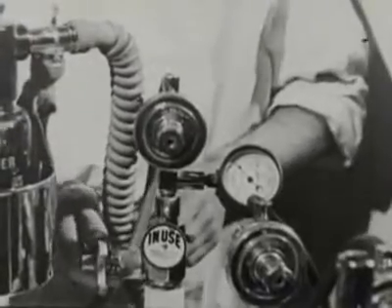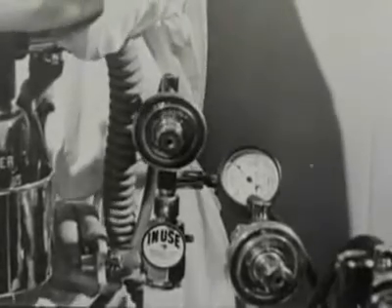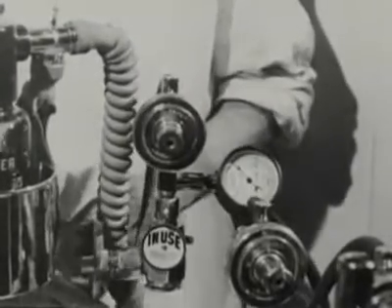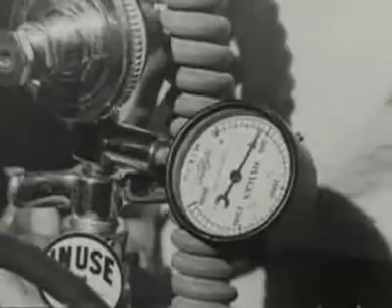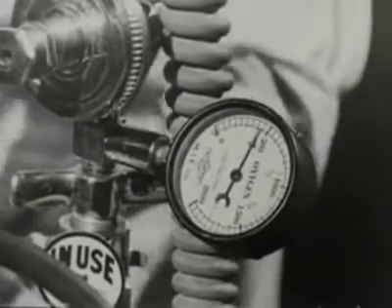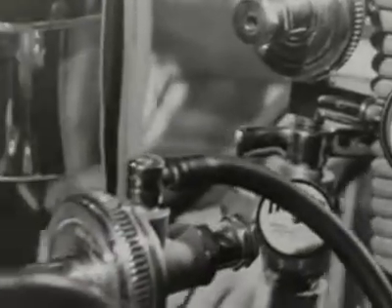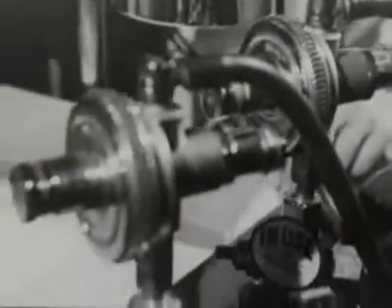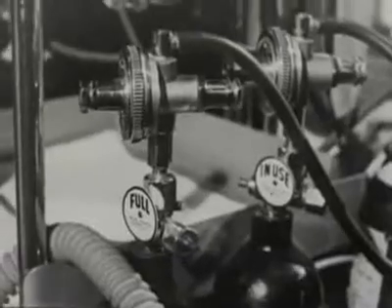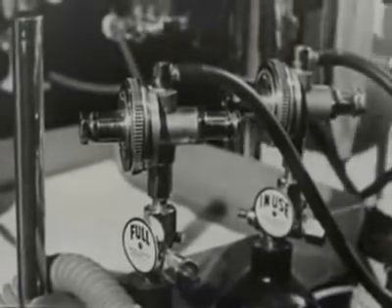Next, test the in-use cylinder in the same way and leave it turned on. A pressure gauge would be of no value on the nitrous oxide or carbon dioxide cylinders because the gas is liquefied and the pressure remains the same until the cylinder is nearly empty.